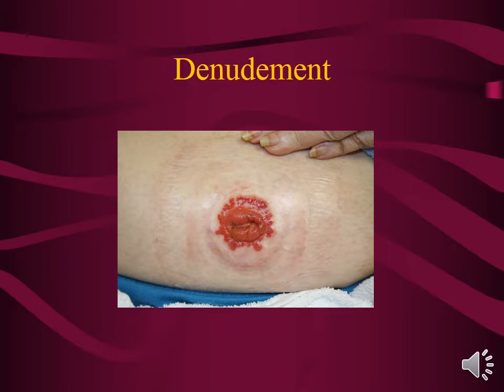This is probably the most common thing that you will see, and it occurs 7 to 8 weeks after surgery. The patient goes home, and they come into the wound ostomy clinic, and their stoma has shrunk because it was enlarged after surgery, and now they have denudement around the area because they kept cutting out the pattern the same way instead of remeasuring their stoma 7 to 8 weeks after surgery. So we put some ostomy powder on that and brush it off and help them remeasure and have them continue remeasuring until we are sure that it has shrunk down the way it's going to shrink down, and it will heal right on up.